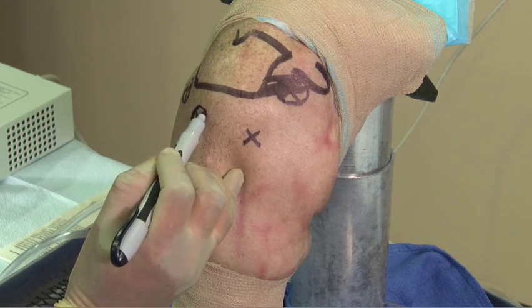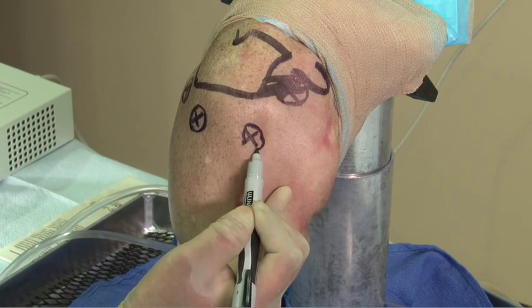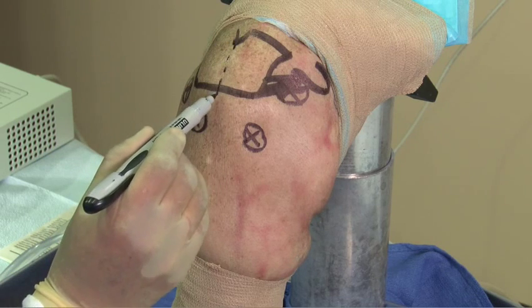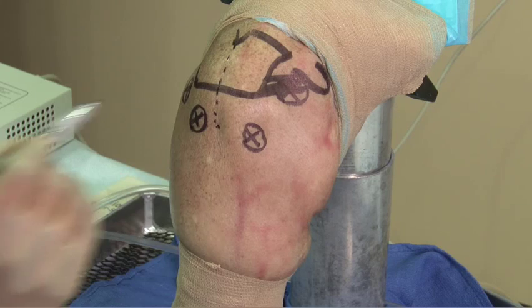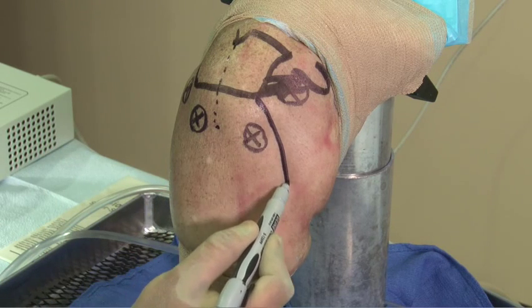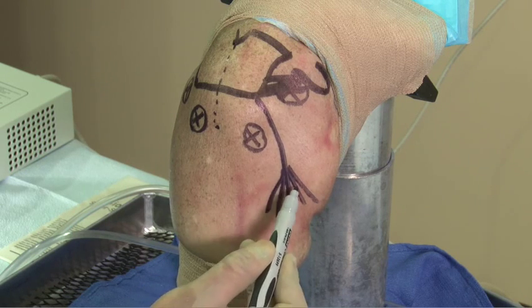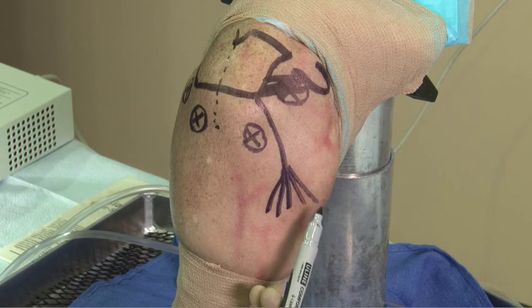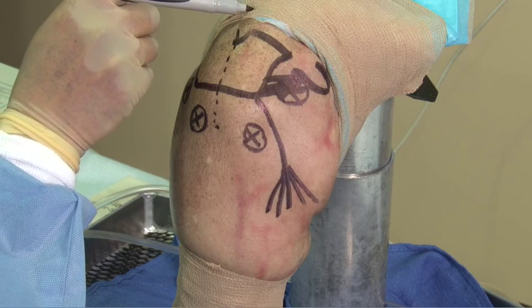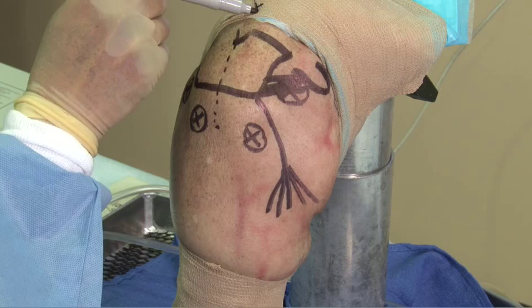Other surgical techniques utilize what is known as a 50-yard line portal that bisects the posterior edge of the AC joint into the mid portion of the acromion. The biceps tendon sits approximately 10 degrees relative to the neutral position of the arm. The suprascapular nerve sits 2 centimeters medial to the posterior corner of the AC joint.